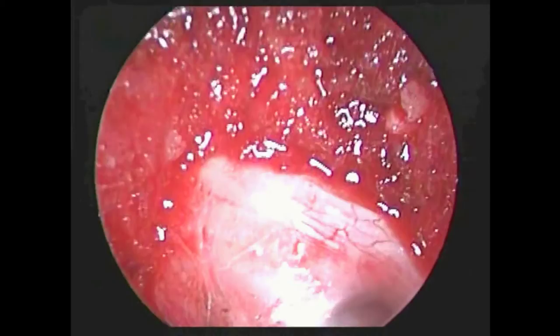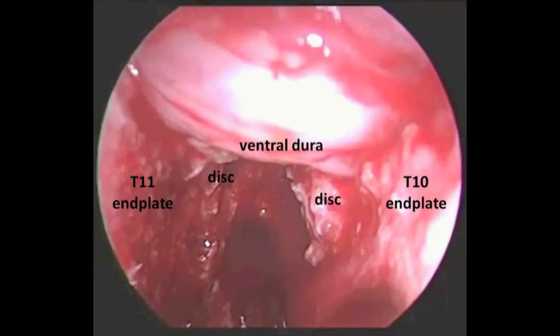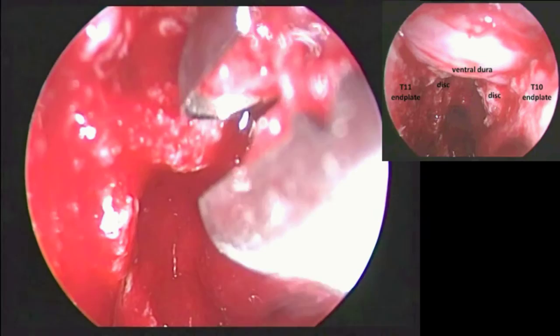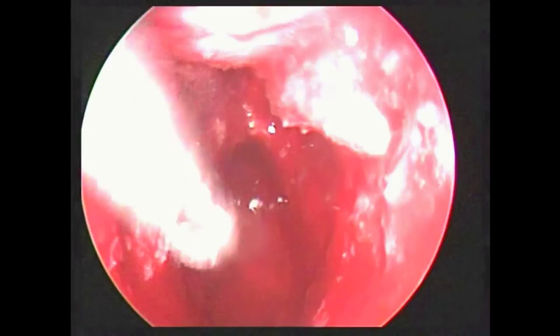A 30-degree endoscope was used for a more panoramic view of the ventral disc and the disk space. One of the residual discs was removed by the rongeur. Complete decompression without any residual herniated disc was confirmed with the endoscope.